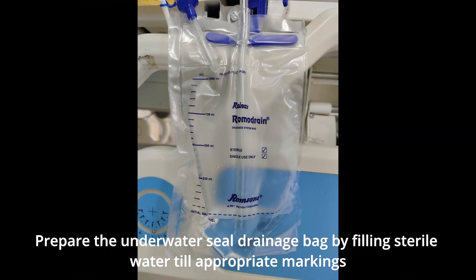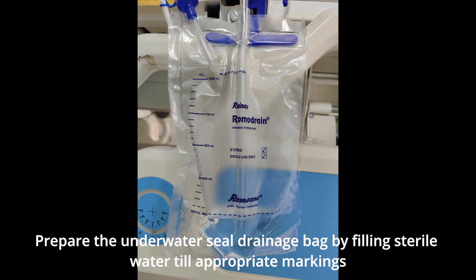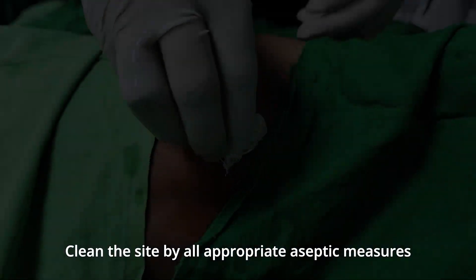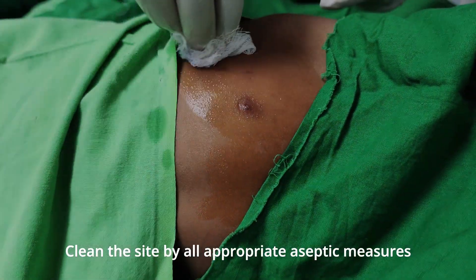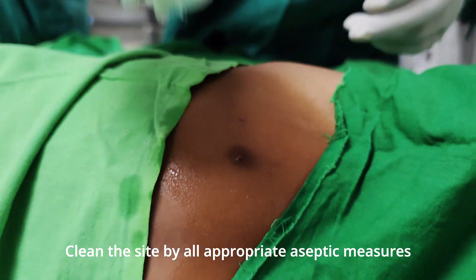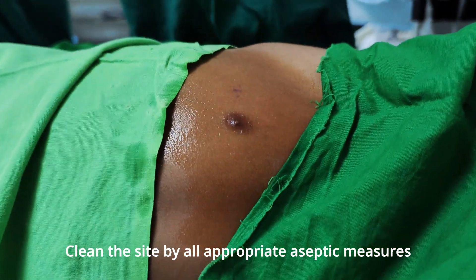Prepare the underwater sealed drainage bag by filling sterile water till the appropriate markings. Clean the site using all appropriate aseptic measures.